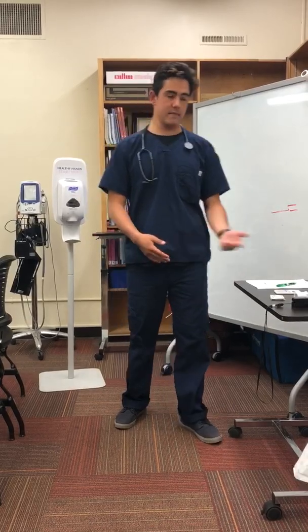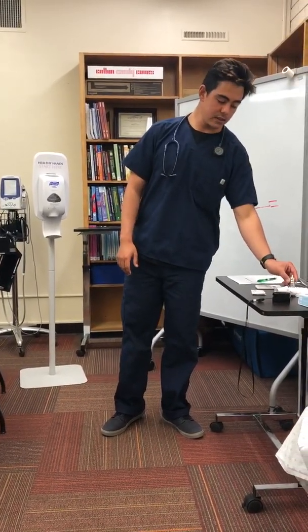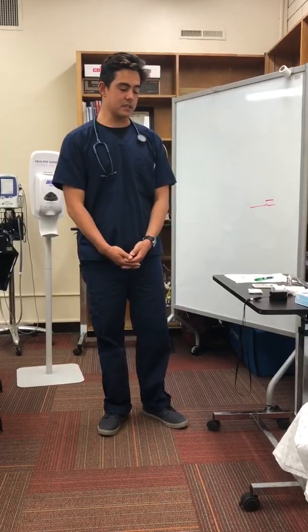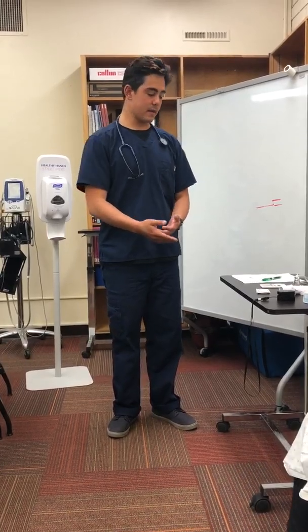Today we're going to be going over the MDI competency. So the first thing we're going to do is review the physician's order for the drug, the dose, and the route, and other pertinent information to this treatment. We're going to be doing a unit dose of albuterol in this treatment. We're also going to review the patient's chart for any pertinent information, for any allergies, for any contact isolation or requirements, any other information that may regard us and the patient.